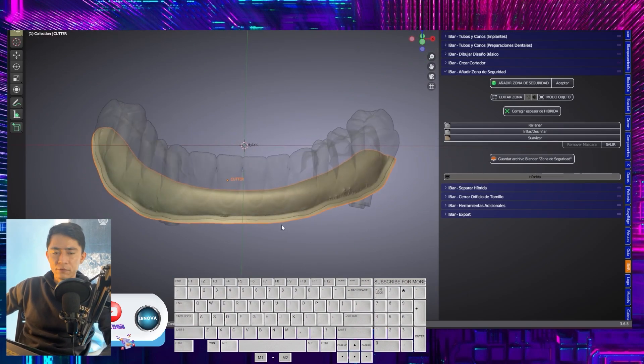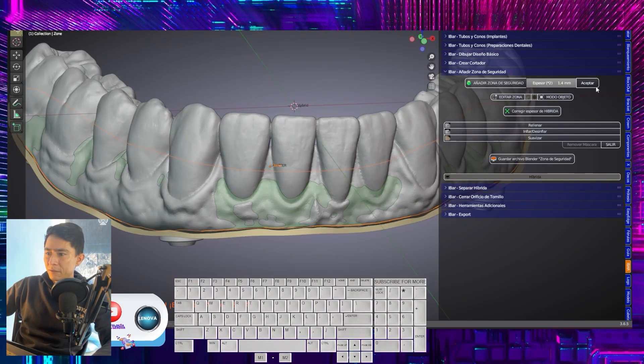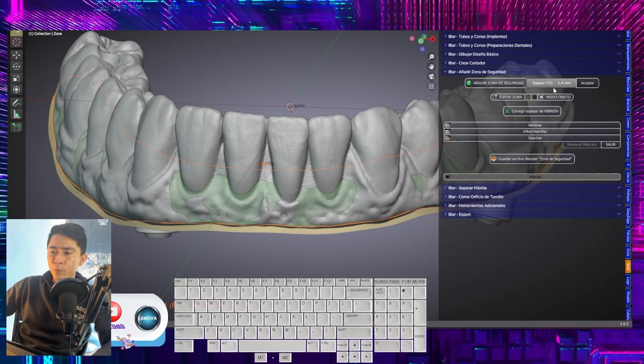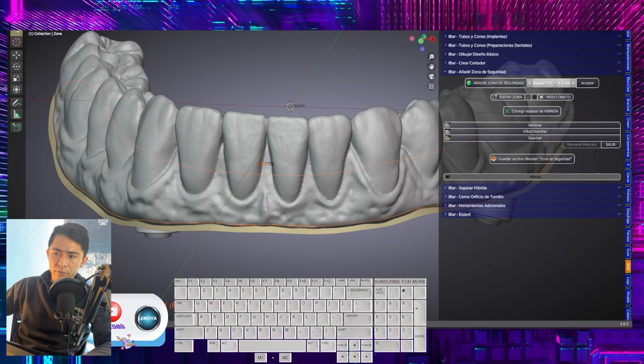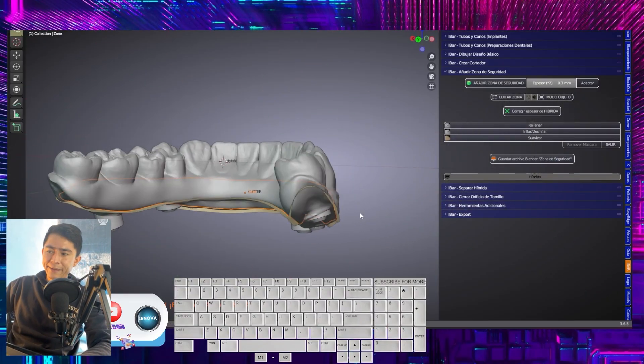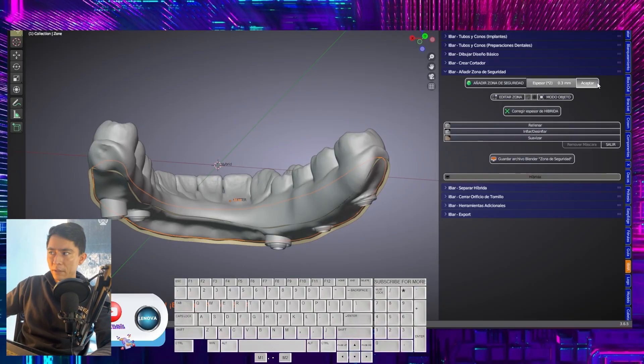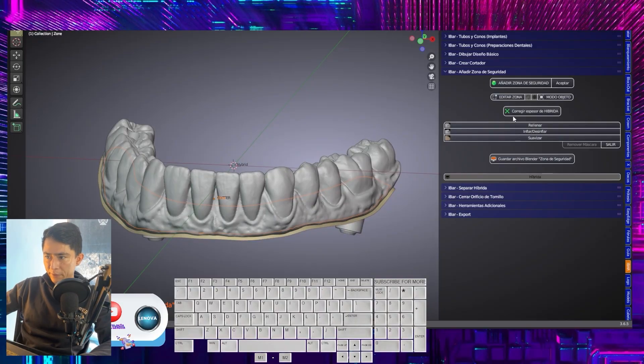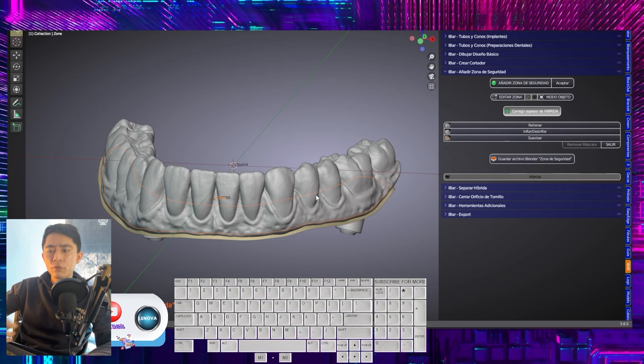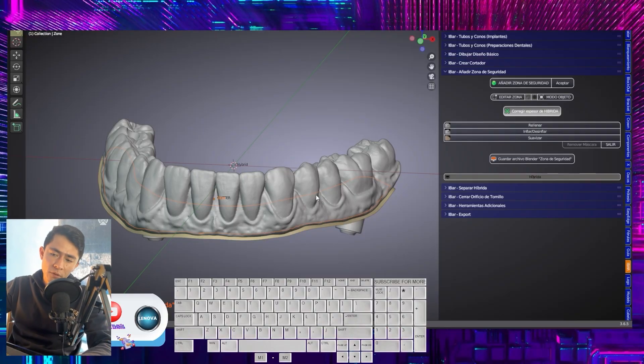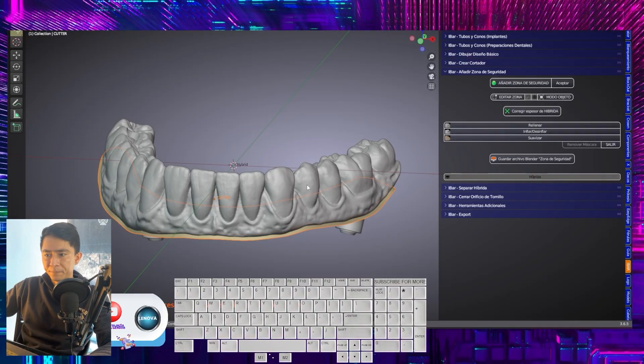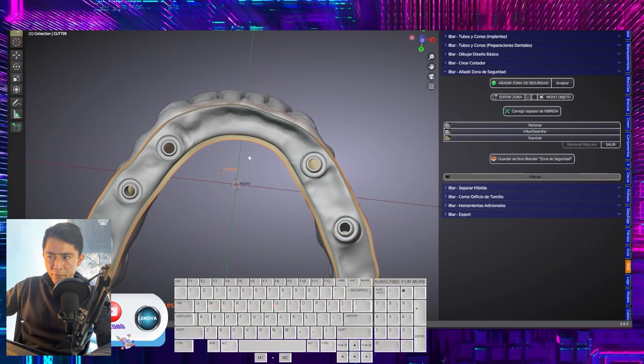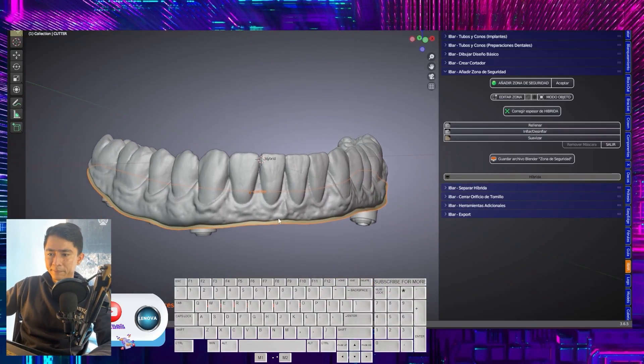Here, what we will do is compensate spaces. I indicate to add the safety zone. Here we have this green mesh presented because we have a thickness of 1.4. We are going to reduce it. This depends a lot on the milling system you are using. This is where you should run tests and see what friction or space is ideal for you. In my case, I will leave it at 0.3. Now we are going to mark correct hybrid thickness. This is so that the spaces are compensated. And where there are very thin areas, we can compensate. Once it's done, it seems like the changes weren't significant, but in reality, they were.